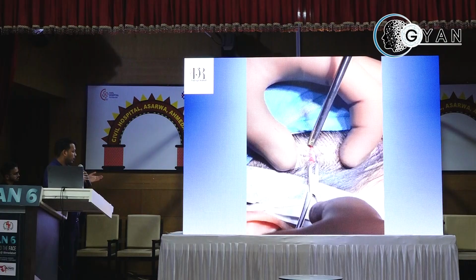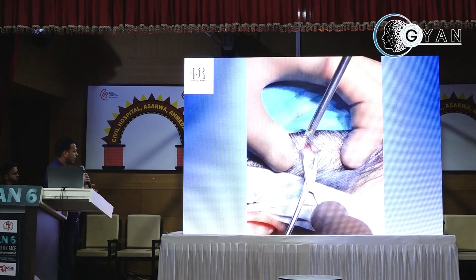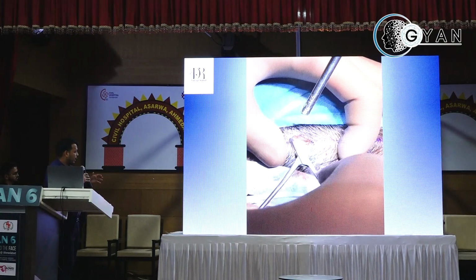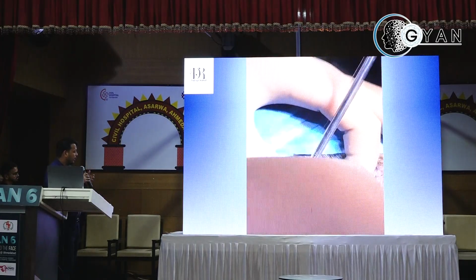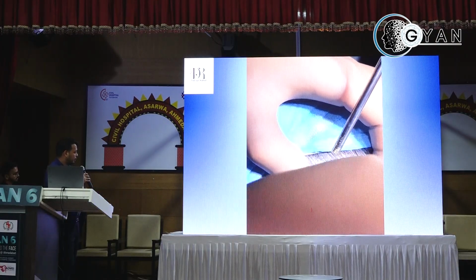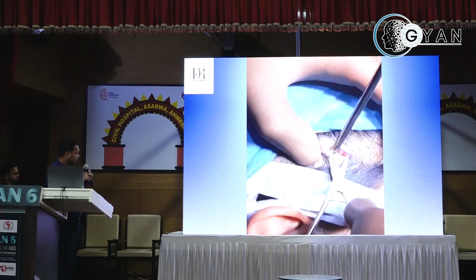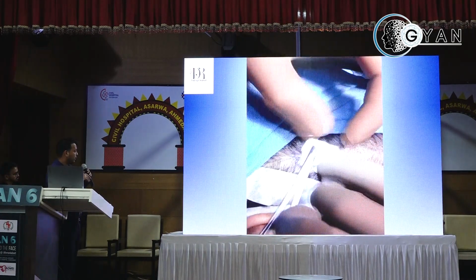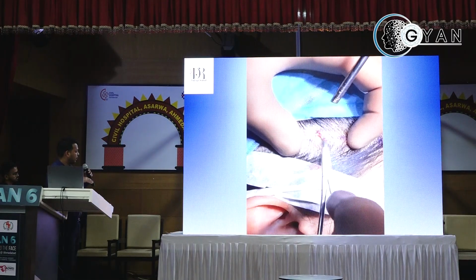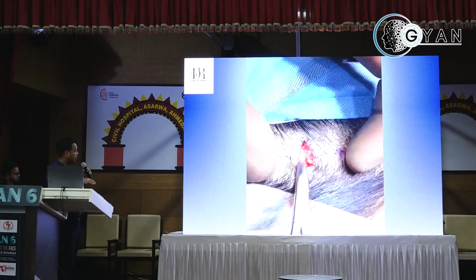We give the incision as a bevel incision, with a 45-degree angulation, so that any hair follicle that is there will not be damaged, and the hair can grow along with the scar line. So there won't be a visible scar after the healing of this incision. Once we dissect the skin and superficial fascia, this is your superficial fascia, where all the main structures are, like the superficial temporal vessels and artery. Once we go further, we again see a white structure, which is the deep fascia.